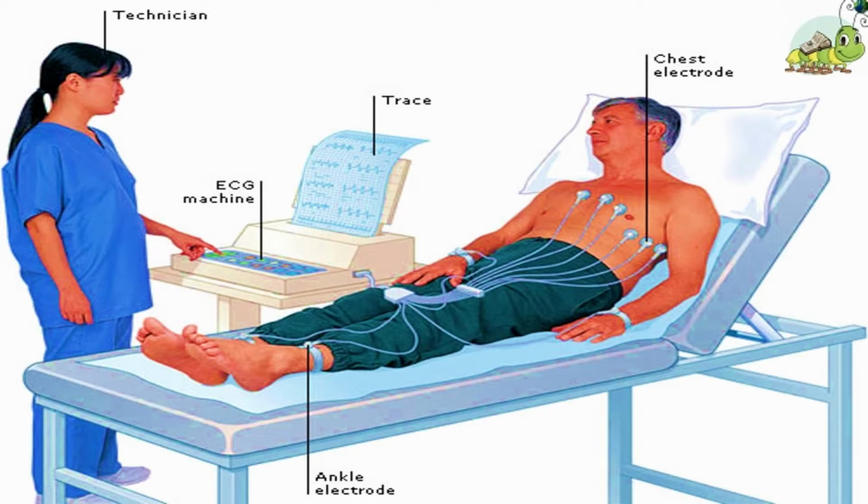In an ECG machine, by careful placement of surface electrodes on the body, it is possible to record the complex compound electrical signal of the heart. This tracing of the electrical signal is the electrocardiogram, meaning ECG, also commonly abbreviated EKG. K comes from cardiology, letter K, from the German term for cardiology.